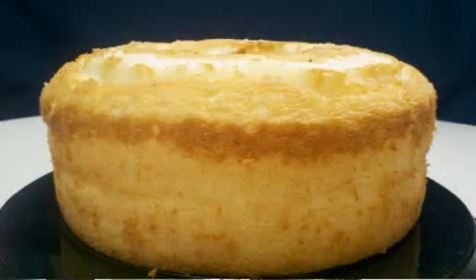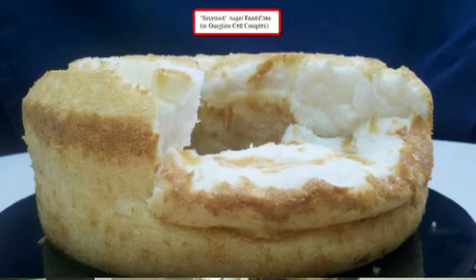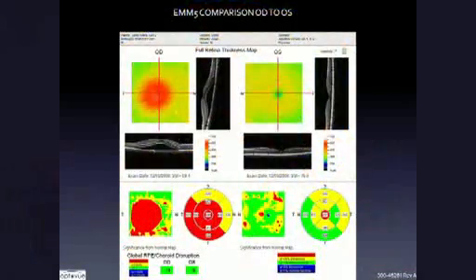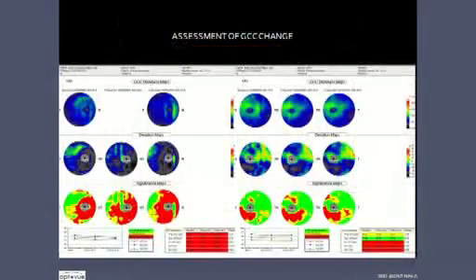So with the retina, this instrument allows us to look for the different layers in the back of the eye, and we're looking for elevations and depressions. I like to use the analogy of an angel food cake that's nice and fluffy, versus it becoming a pound cake, which is condensed. The diabetic, the hypertensive, tumors, detachments, all sorts of conditions in the retina can be found and evaluated with this.